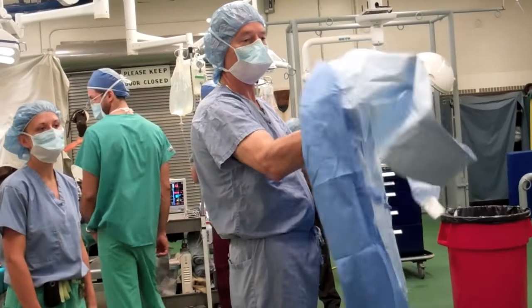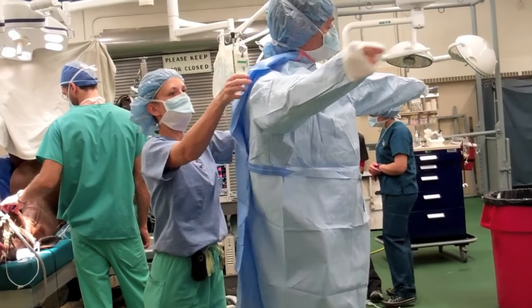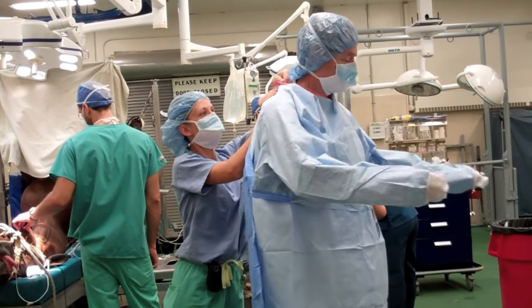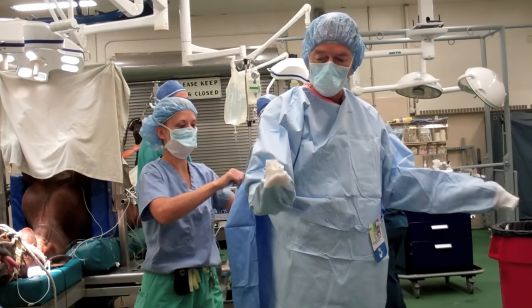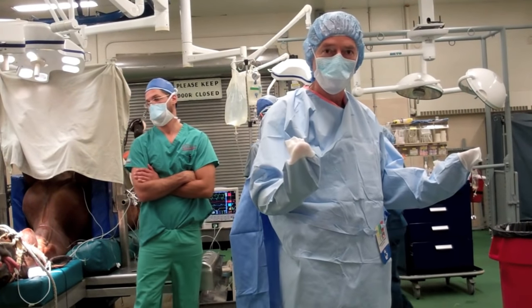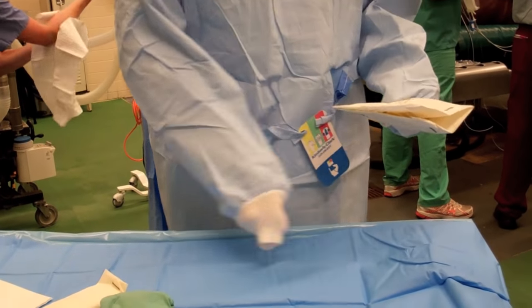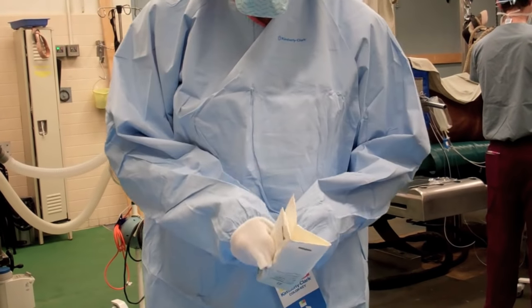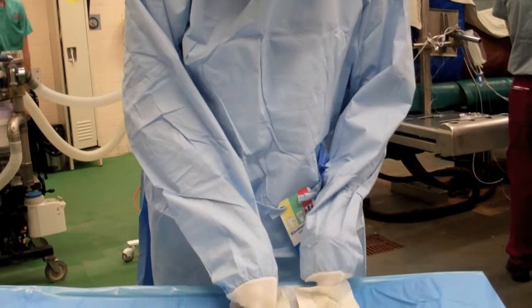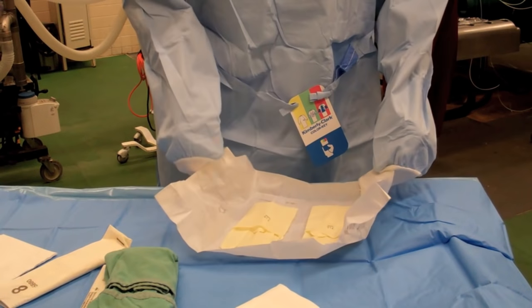Now I'm going to put my arms in the sleeve. Importantly, with the closed gloving technique, you'll notice that my hands are not extended through the cuff of the gown. Since my field is sterile, my cuffs are sterile, and the glove pack is sterile, I can open it without fear of contamination.